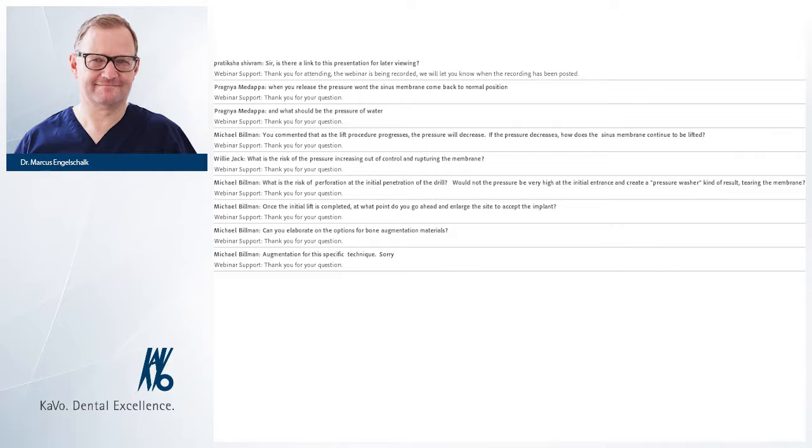Well, we see the gold standard is the bone of the patient, I would say. But today, for sinus floor elevation, there is no use in collecting the bone of the patient from the mandible or from the hip. Today, we can use some other materials.